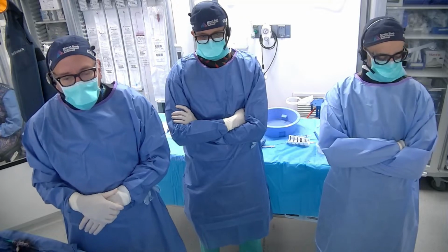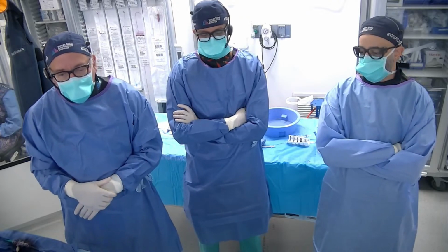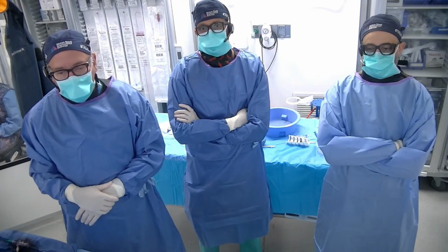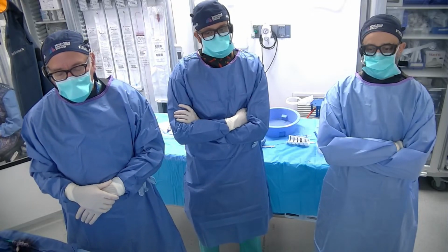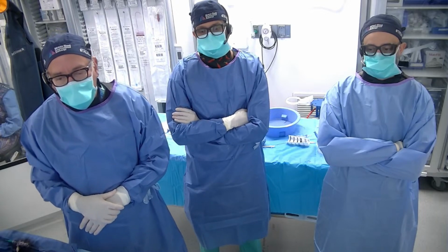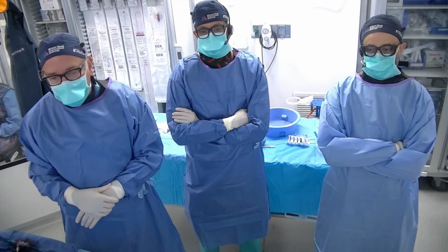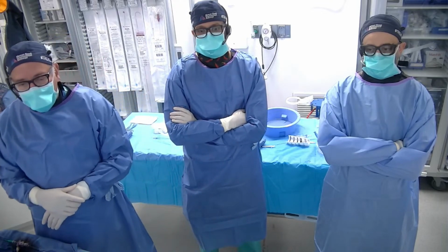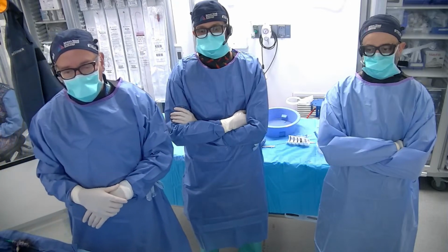But since we're going radial, the access is really alleviated completely with a guide from above, and so we've taken a much more comprehensive approach to renal artery revascularization. We plan on correcting every abnormal renal artery that we find this morning.